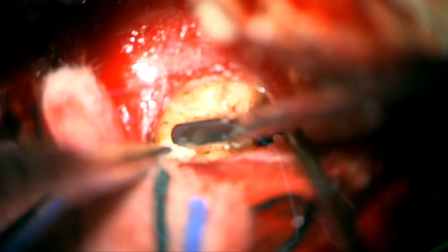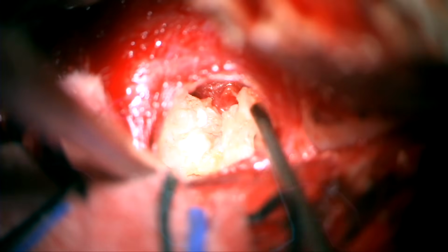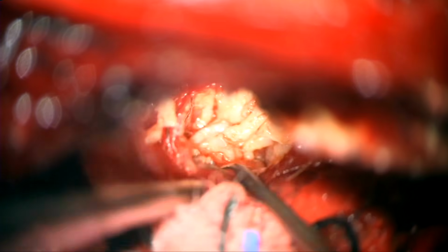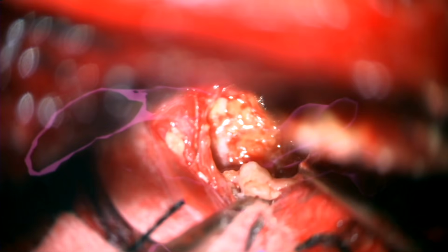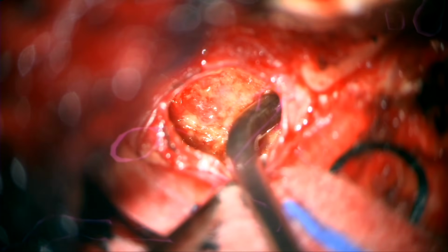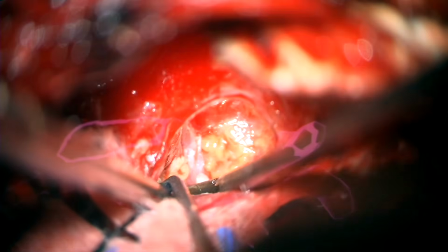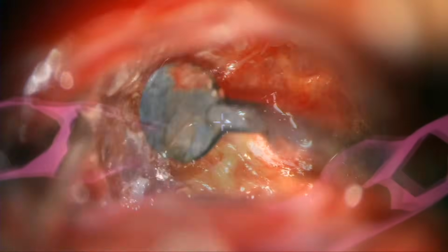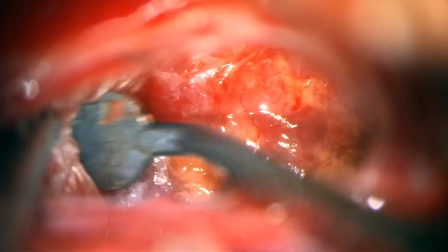We are now looking into the deepest portion of the tumor, and we use an interesting feature here of augmented reality to superimpose the location of the cavernous carotid artery. And this helps us with our resection, but especially the Doppler ultrasound is very useful to map the carotid as we get to the deepest portion of the tumor resection.